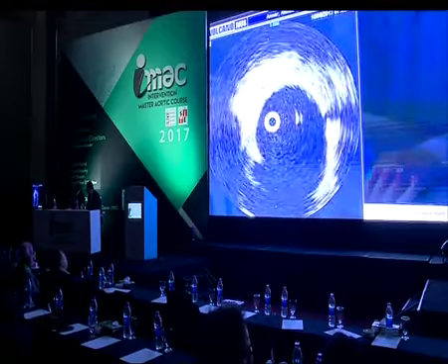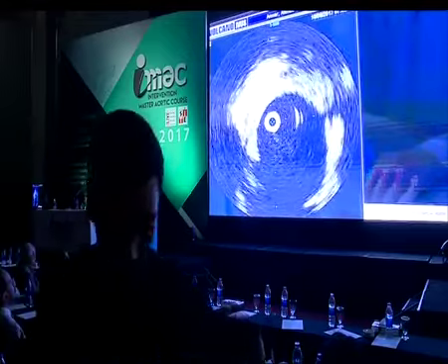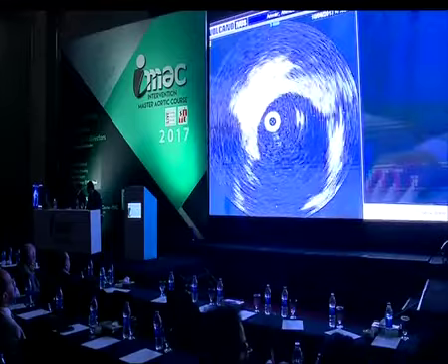Are you opposite the ulcer right now? Yes, you are opposite the ulcer, yes.